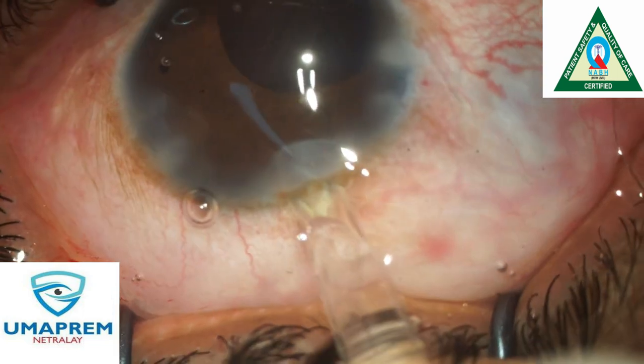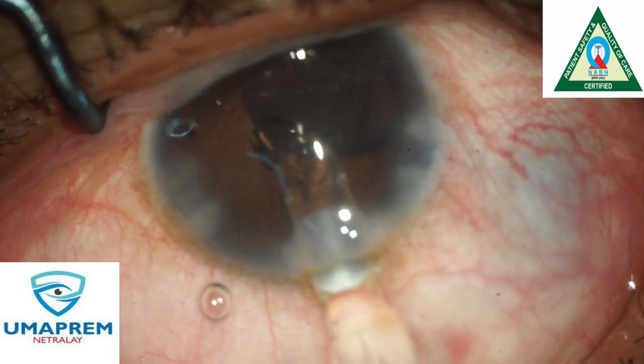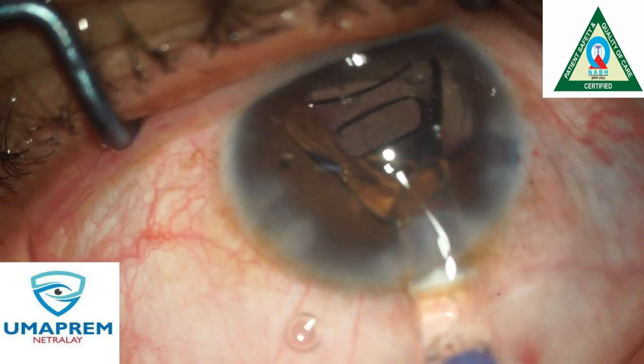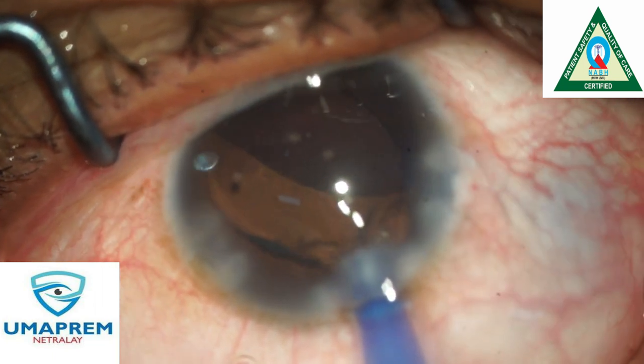In these types of cases, the zonules are very weak, so we perform every step very gently. We choose a plate-haptic IOL for this patient for better stability of the implant.